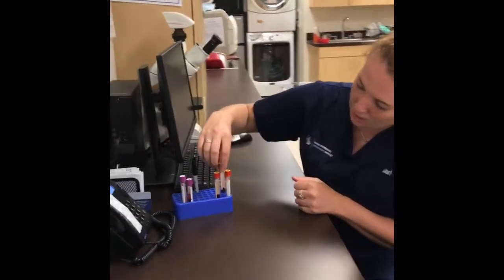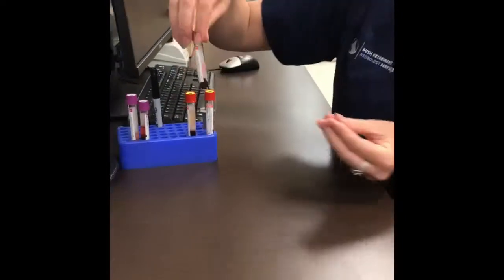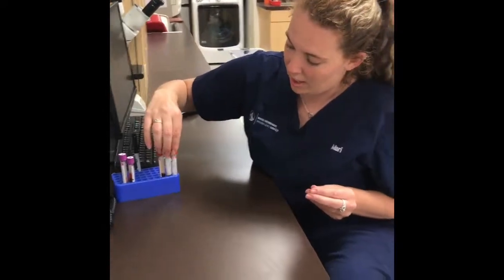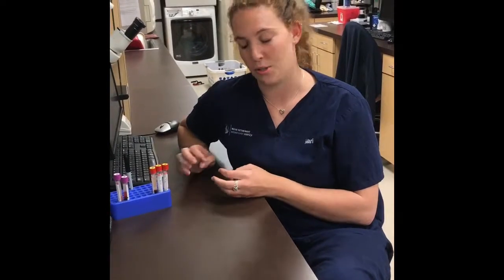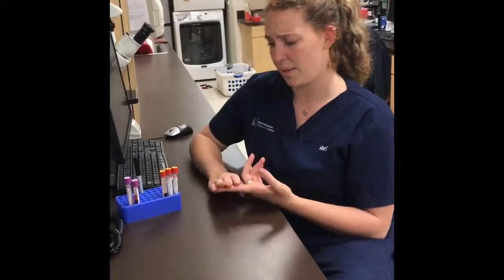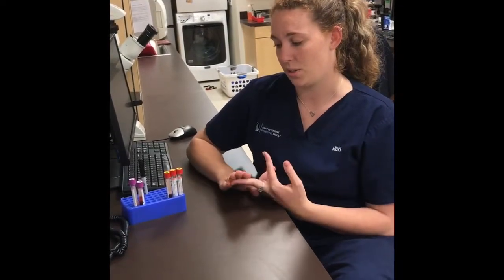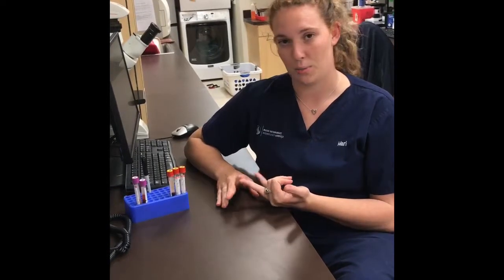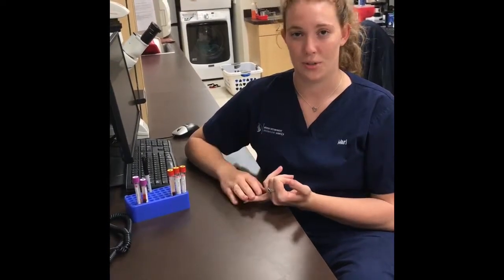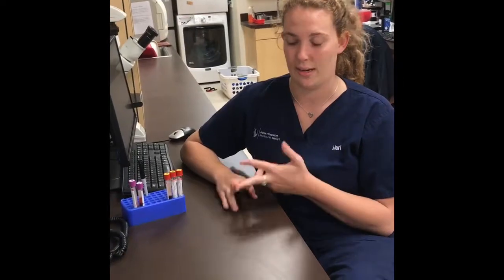Here's an example of a lipemic serum sample. Lipemia is caused by the patient not properly being fasted and having a fatty meal prior to your blood draw. Lipemia can cause hemolysis itself. It can cause dilution of your sample. It can cause increases in things like your total protein, as well as your glucose or your liver enzymes, and it can cause decreases in your pancreatic enzymes such as your lipase and amylase.